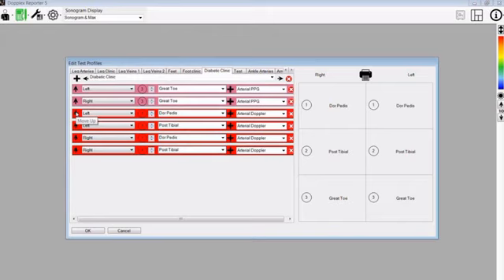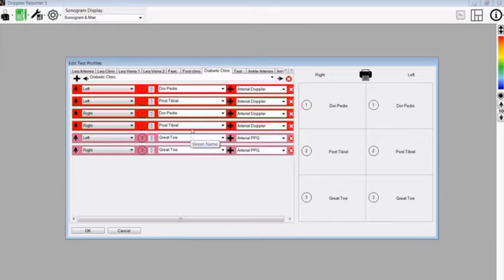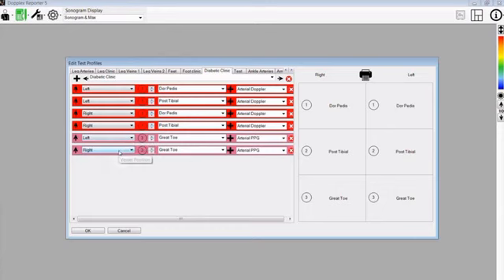If for any reason you want to change this around, what you do is just move the vessel up and change the position of the vessels being investigated to a different order. So now we will be doing the left dorsalis pedis and then posterior tibial, followed by the right dorsalis pedis and posterior tibial, followed by the left and right great toes. This is the profile I will use to demonstrate the next section.